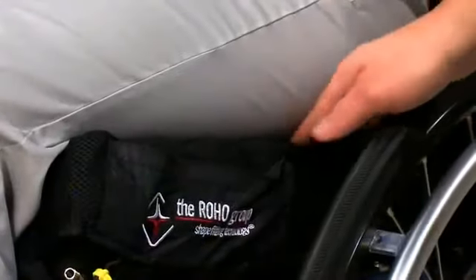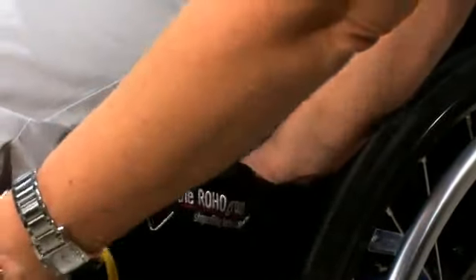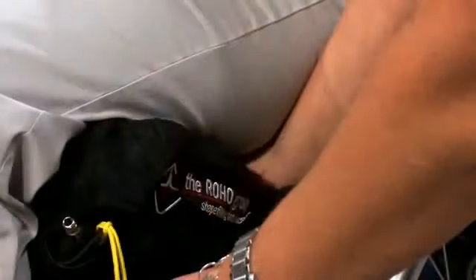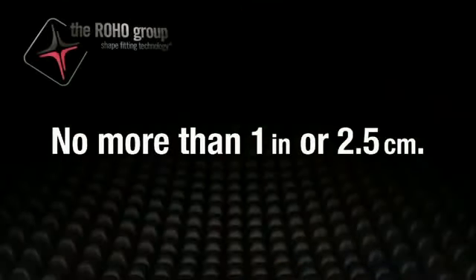Next, slide your hand between the cushion's surface and the individual's bottom. Lift their legs slightly and feel for the lowest bony prominence, then lower the leg to a sitting position. Next, turn the air valve counterclockwise to let air out while keeping your hand under the individual's lowest bony prominence. Release the air until you can barely move your fingertips.